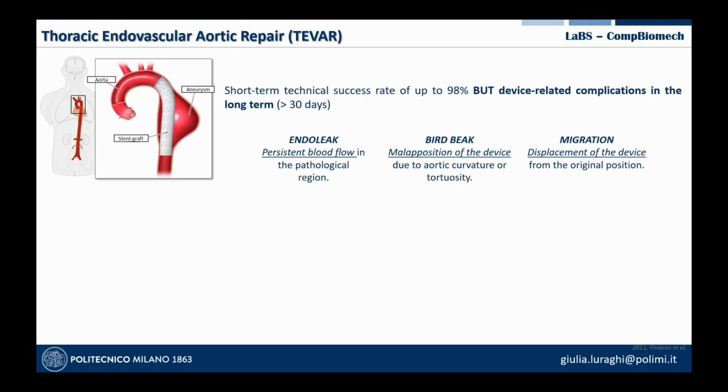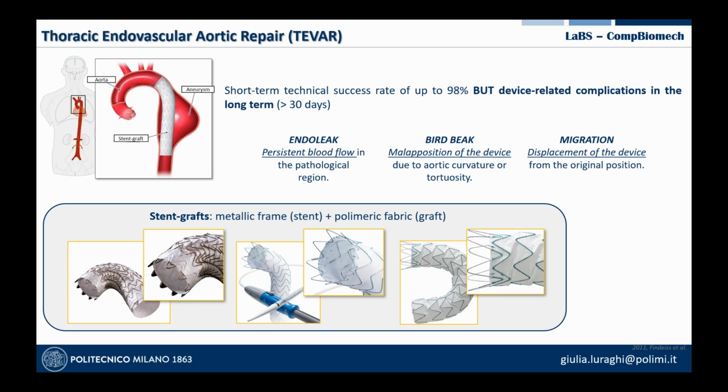As for the TAVI, also here with TEVAR, it's a common procedure in the clinical practice, but there are still complications, especially in the longer term. For example, endoleak, so that there is still blood flow in the pathological region after the procedure. Birdbeak, which is a malapposition of the device due to the curvature and the morphology of the aorta, and migration, so the displacement of the device during the long-term follow-up.